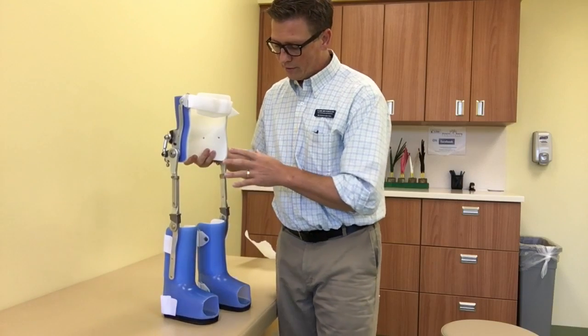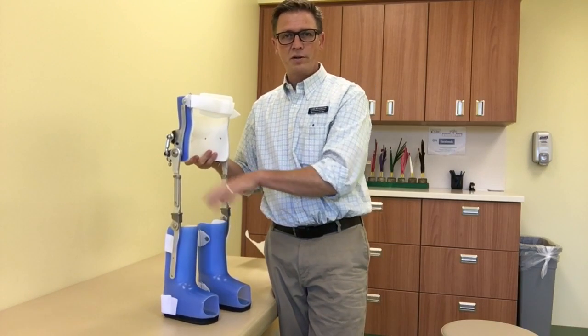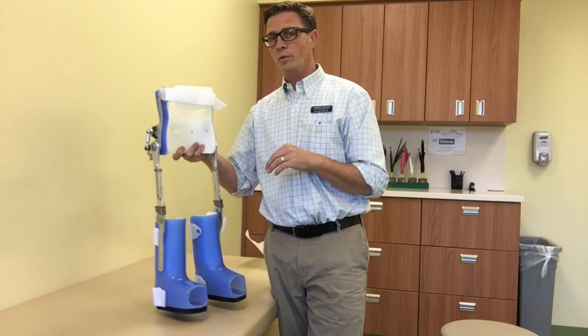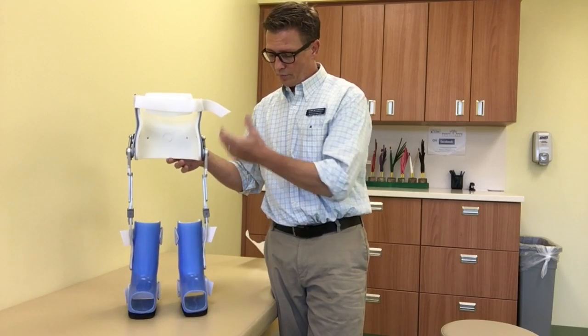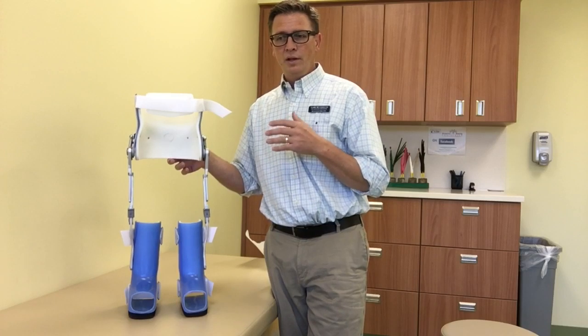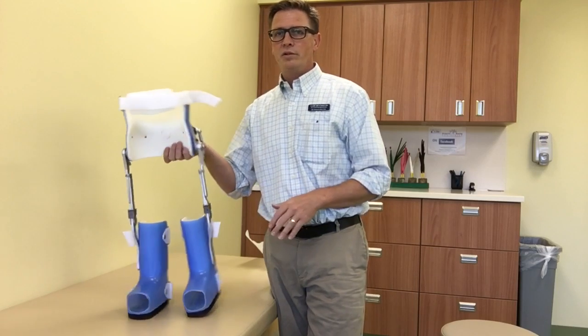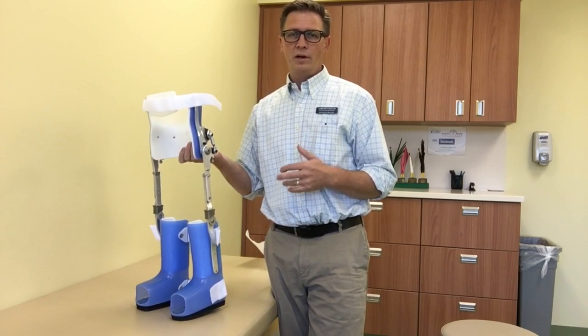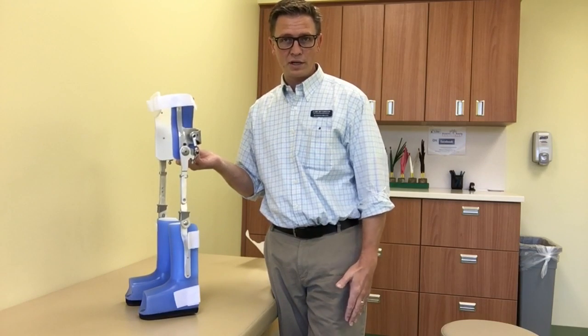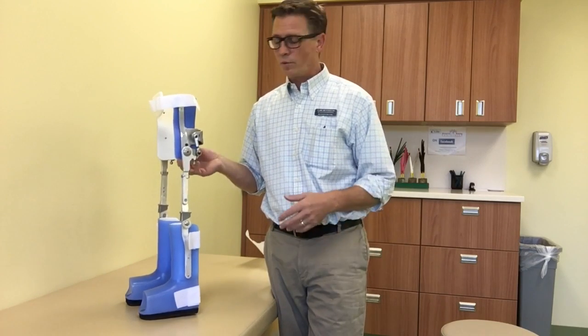This particular model is designed to have the AFO sections fit right over top of whatever shoes and other AFOs the patient would be wearing. We can also make them with more of a standard KAFO, which goes down inside of the shoe, but this is a nice option to be able to put it on and take it off more easily and more quickly without having to completely remove a CAFO or AFO section that the patient would otherwise be wearing while they're in their chair.